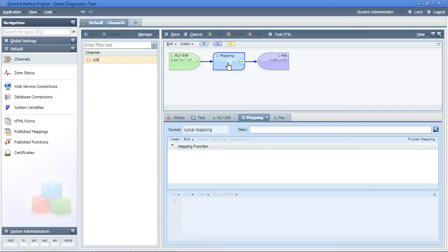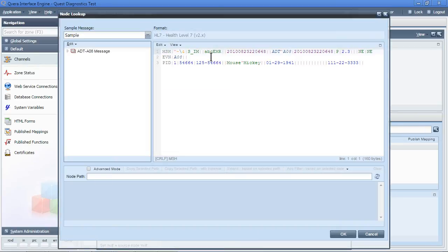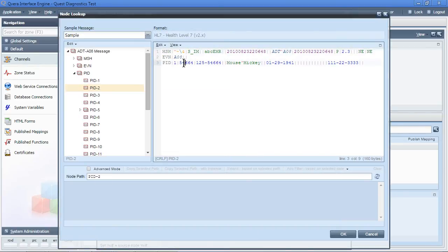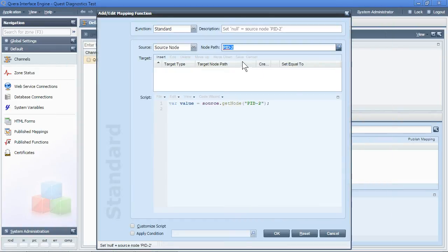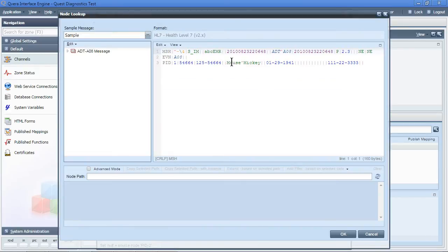We will now perform the two mappings. The first mapping will be to take the patient's ID from PID2. I just simply click into the PID2 field and copy that to the output message in PID4.